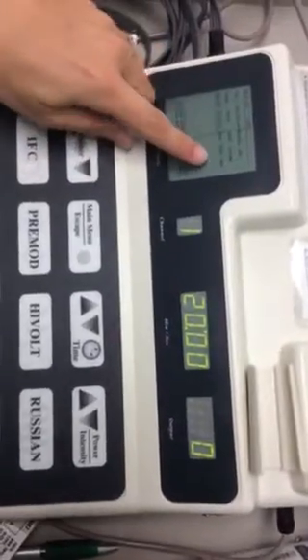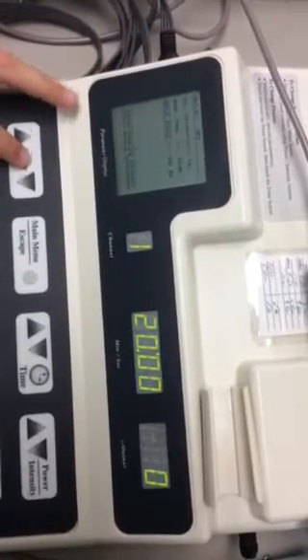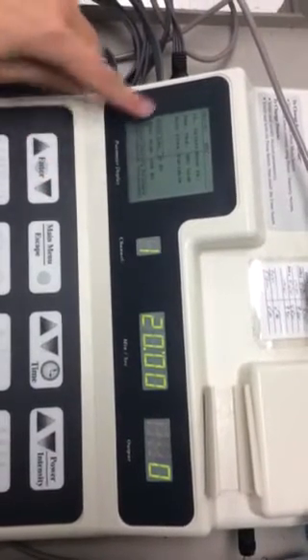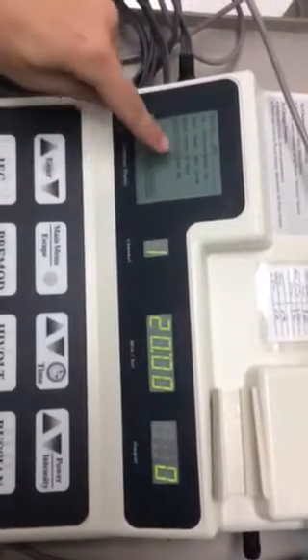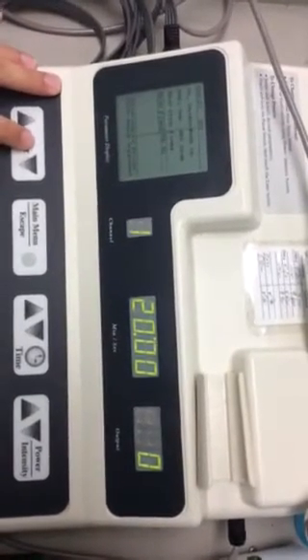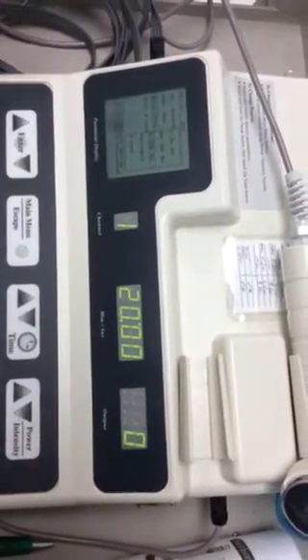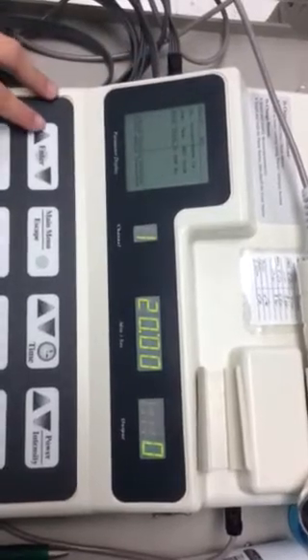Beat frequency, you want it to mimic conventional, so 80 to 150 is good. Or you can set it yourself if you want to set a high or low, or if you would like to fix it at a certain level. 100 is normally what we use. Setting it at an unfixed will also allow it to modulate between 2 different numbers, or a set of numbers, so that you don't get accommodation.